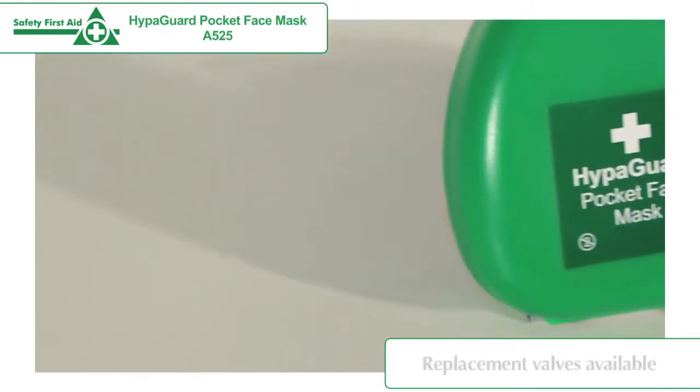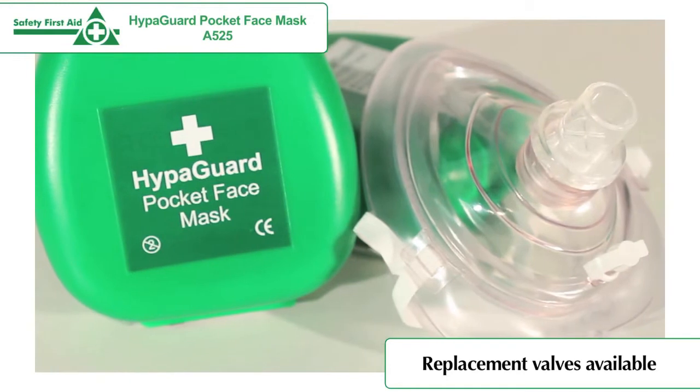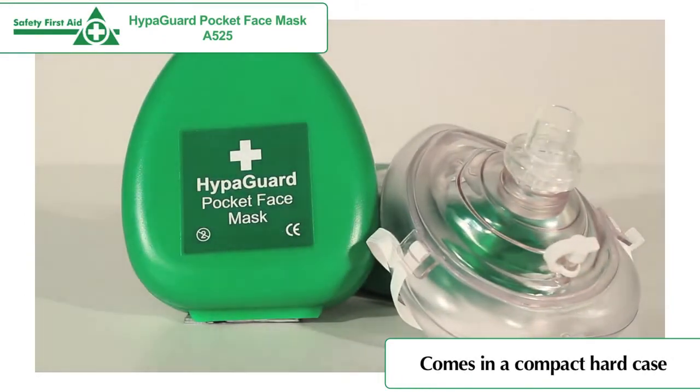The valve is for single use only and replacement valves are available to purchase separately, making the face mask cost-effective. The HypaGuard Pocket Face Mask comes in a hard, durable clamshell case.